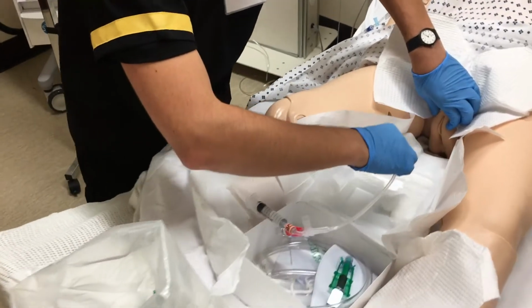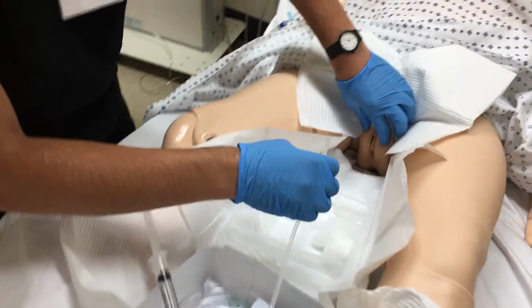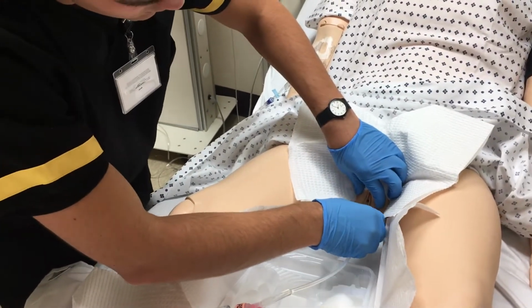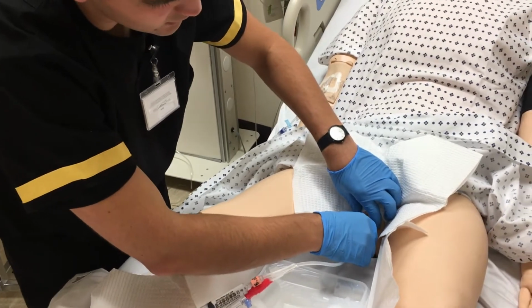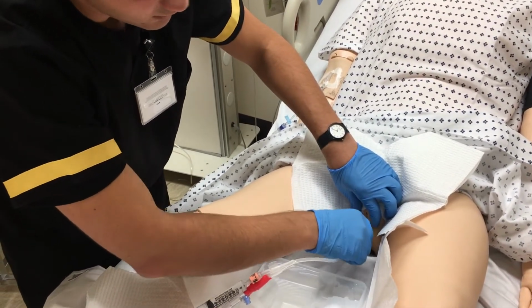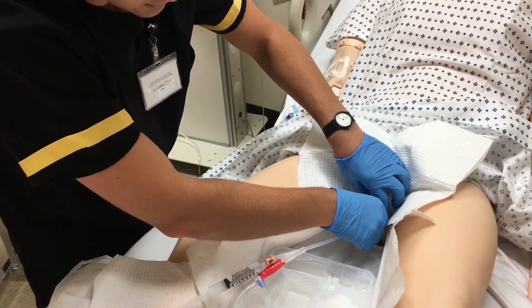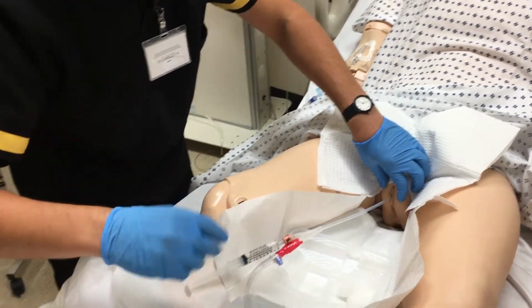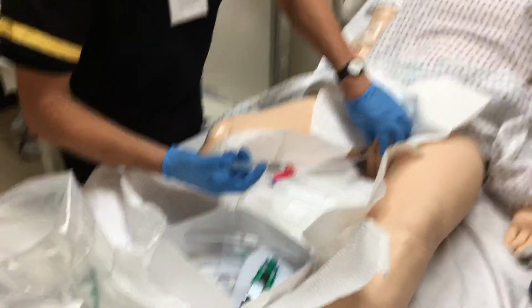Okay, now I'm going to get some lubrication on my catheter, and I'm going to insert it 2 to 3 inches. Now I need you to take deep breaths, then I'll go 2 to 3 more inches, and we're in. That was easy. So I'm going to inflate the balloon so it can stay.